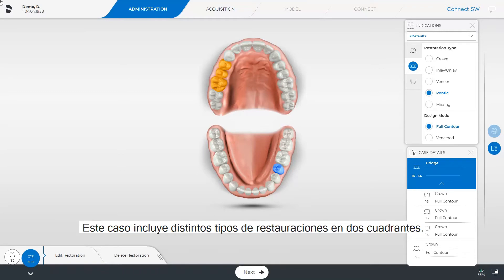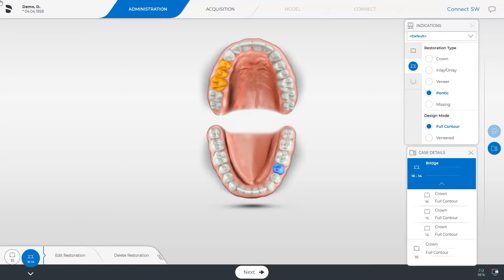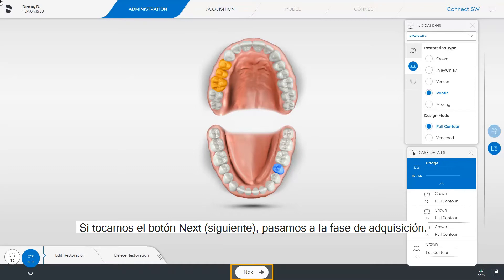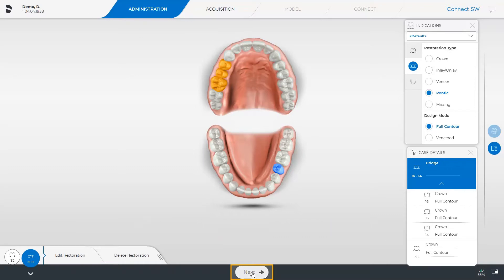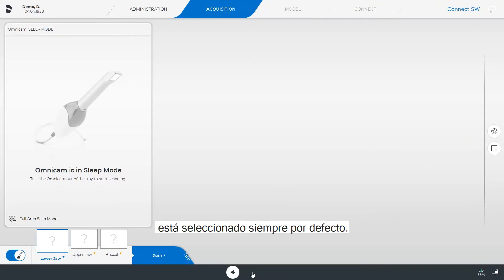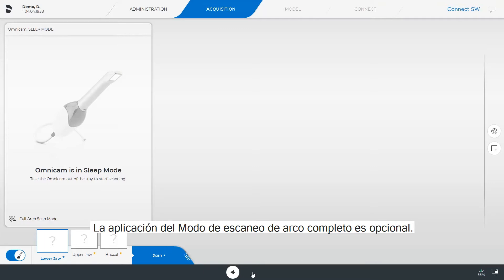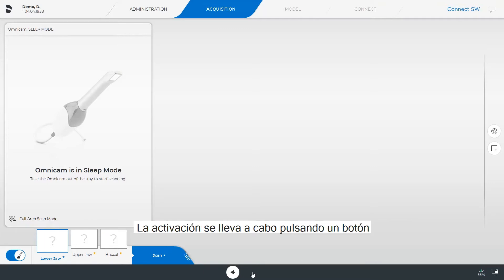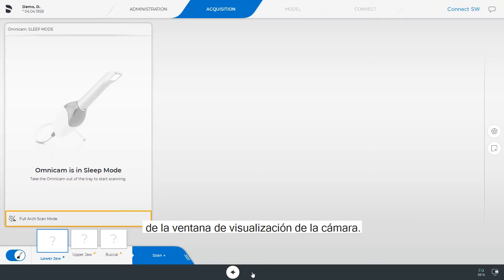Our case covers different types of restorations in two quadrants. By tapping Next we get to the acquisition phase. In the acquisition phase the standard scan mode is always selected by default.